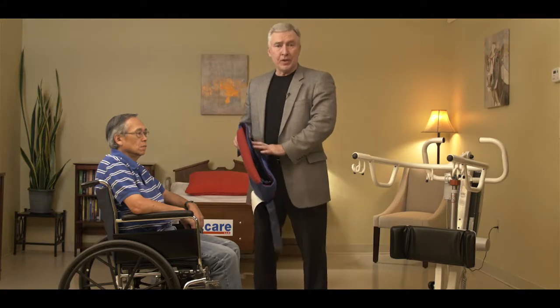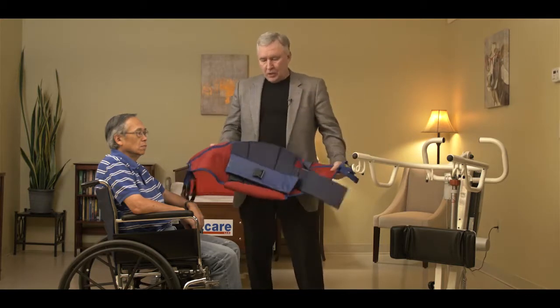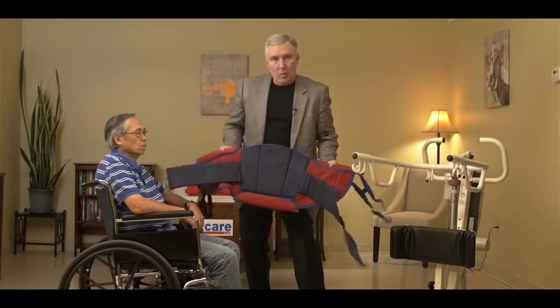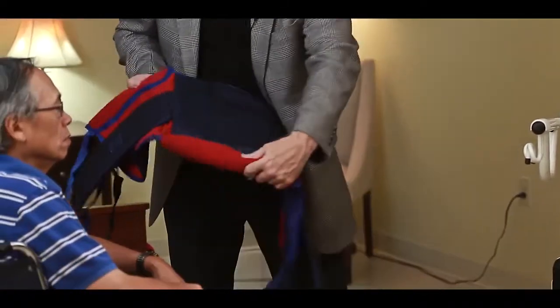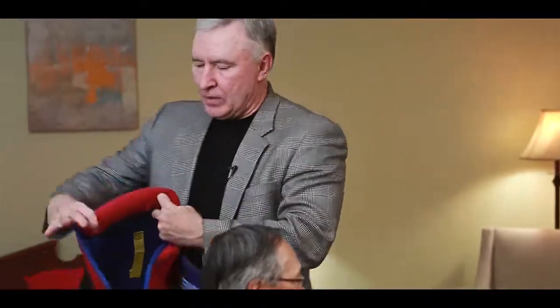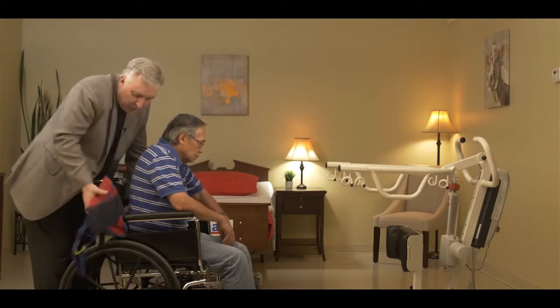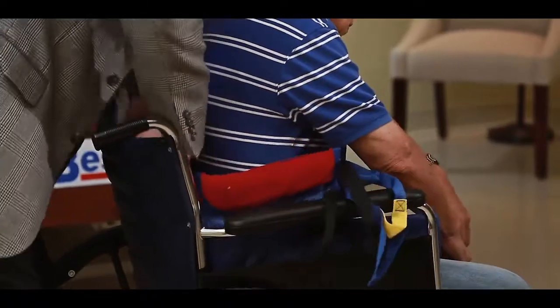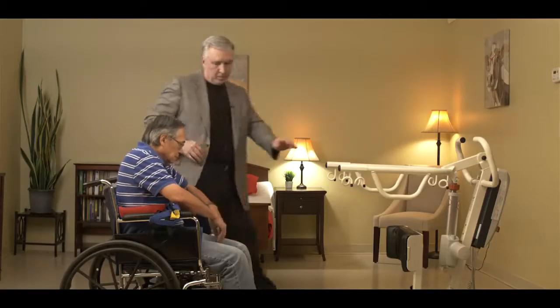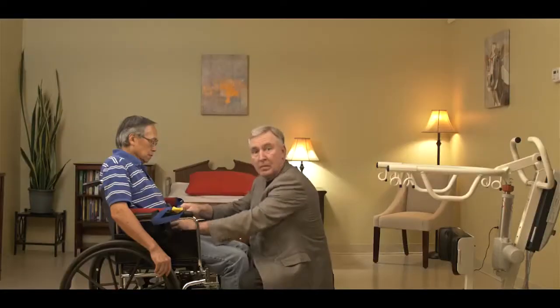Now it's time to show you how to use the stand assist sling with the SA family of sit-to-stand products. You can see that the stand assist sling is shaped like so, with an additional support strap in the center and a cushion at the bottom. The cushion at the bottom is what's actually going to lower down behind the patient in the lumbar support area. To place it on the patient, lean your patient forward just slightly, take the sling, and tuck it down behind the person until the lumbar support is touching the chair. Then bring the support strap around the person's waist and buckle it.